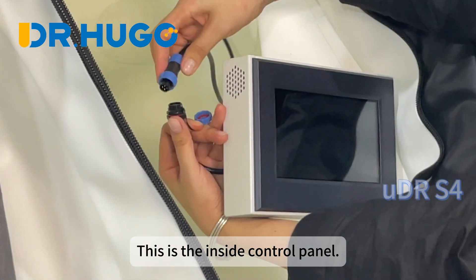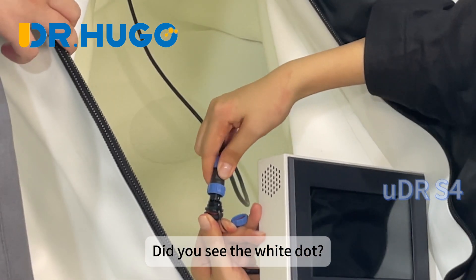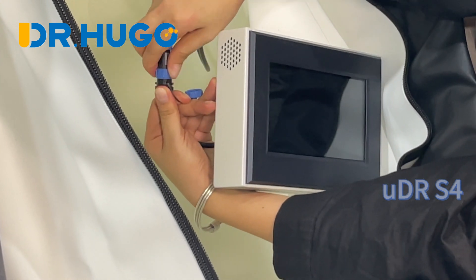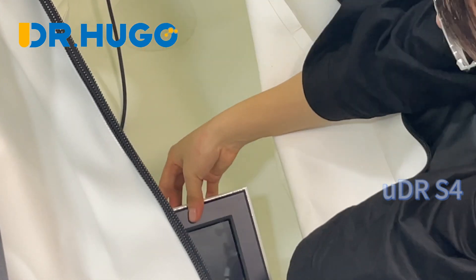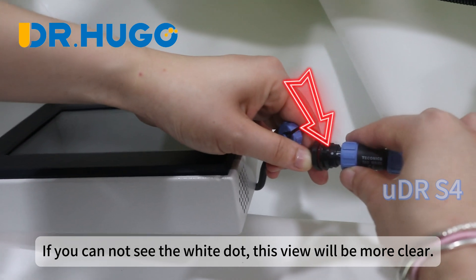This is the inside control panel. The UI display is the same as the outside concentrators. Did you see the white dot? Align with the white dot and plug in the connector. If you cannot see the white dots, this view will be more clear.